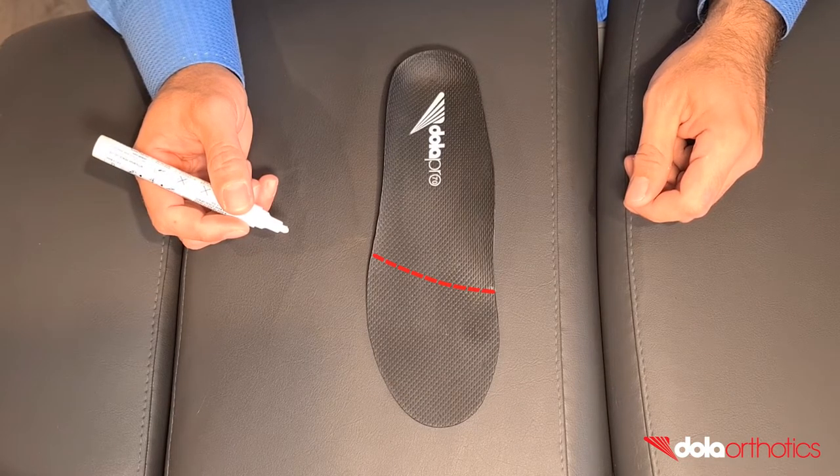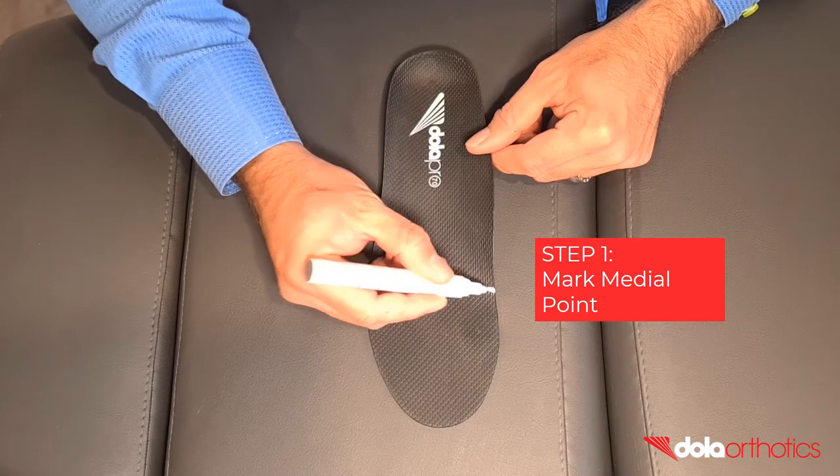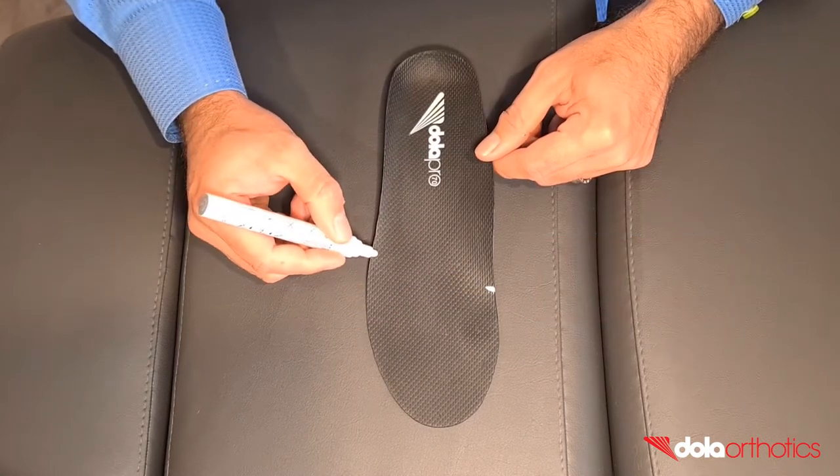The reduction requires two landmarks connected by a curve to indicate your grinding line. Step 1: Mark the medial point of the curve. This will commonly be a point behind the first MPJ.